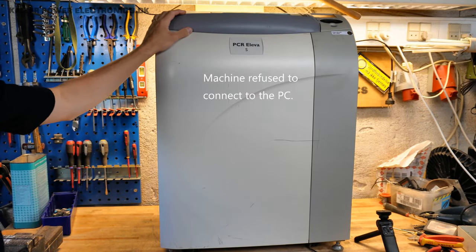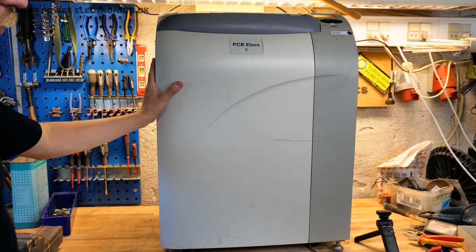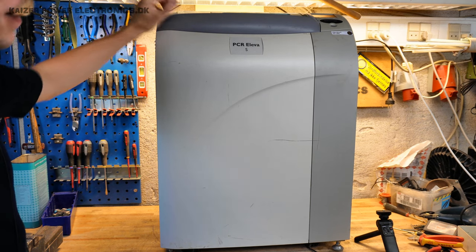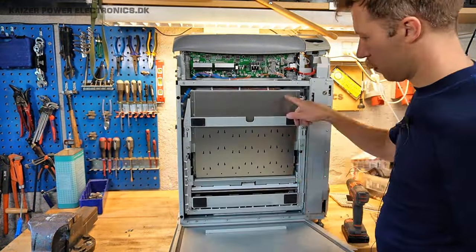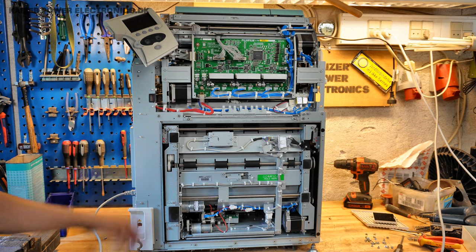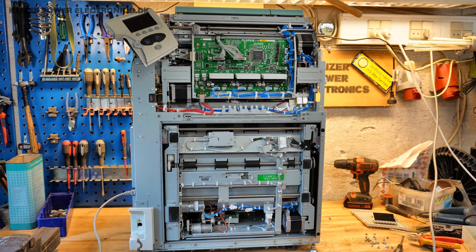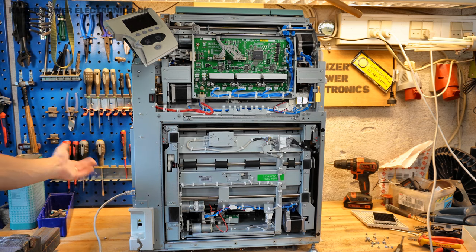Getting the image plate scanner up on the table is absolutely no joke because this is around 70 to 80 kilograms — it weighs just about as much as myself. Luckily I have a strong wife who helped me get it lifted onto the work table. So let's get this torn apart. Let's just try to turn it on and see what happens.